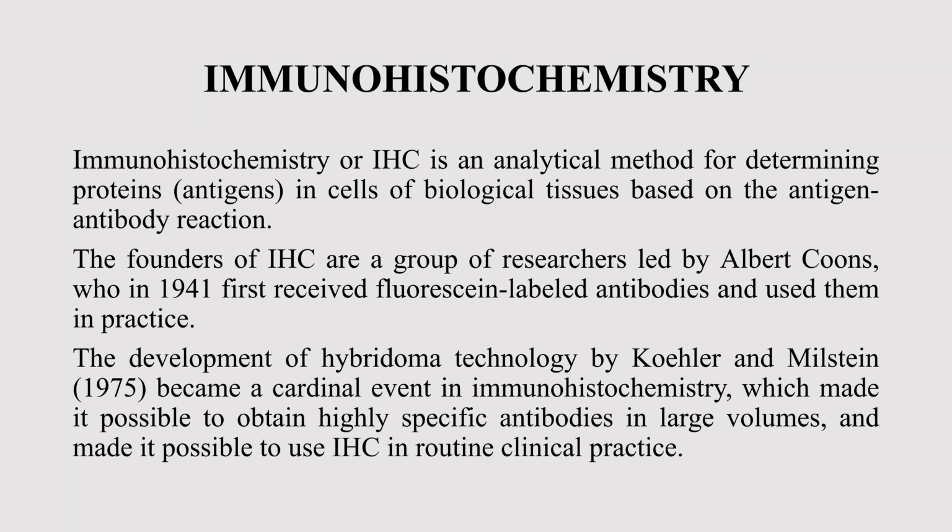Later, in 1975, the development of hybridoma technology led to intensification and the next level of production of these antibodies, which are highly specific.